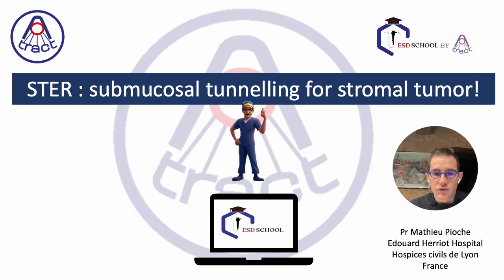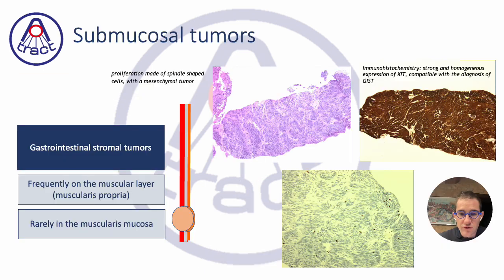Today, we will present a complete case of a technique which is similar to ESD, but which has a particular strategy, which is the submucosal tunneling for stromal tumor, which is called commonly the STER procedure.